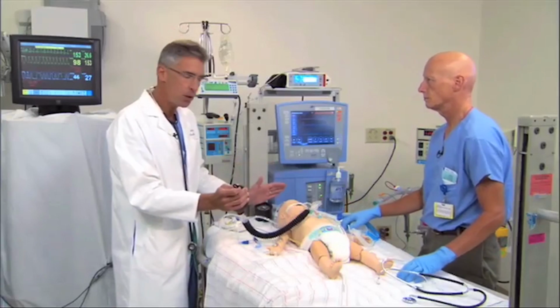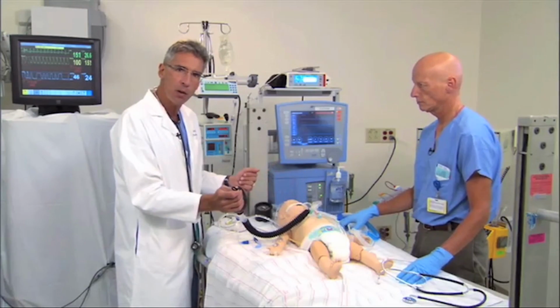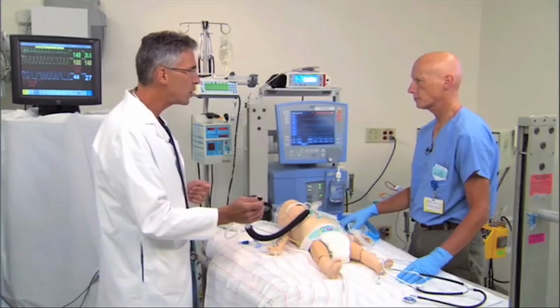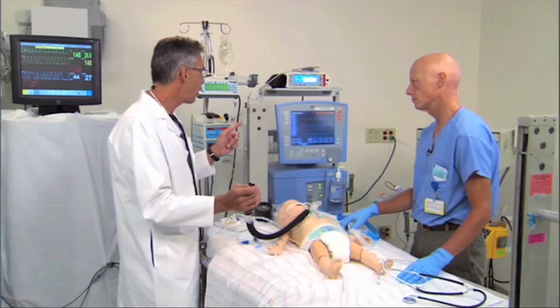So almost all the time, patients who respond to suctioning and bagging will respond to the use of high-frequency oscillation. Transition to high-frequency oscillatory ventilation. So now we're going to move to transition to high frequency. Barry, you mentioned our mean airway pressure. Remind me again where we are in terms of a mean.